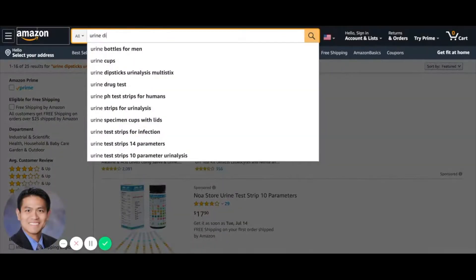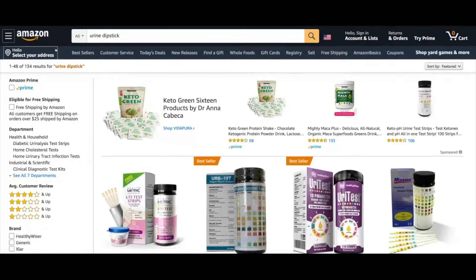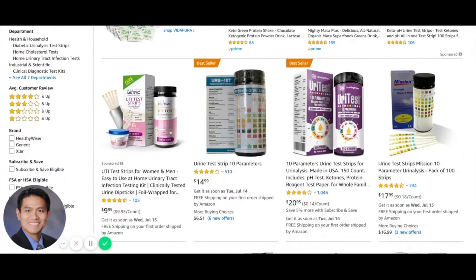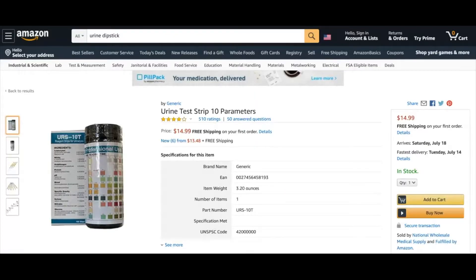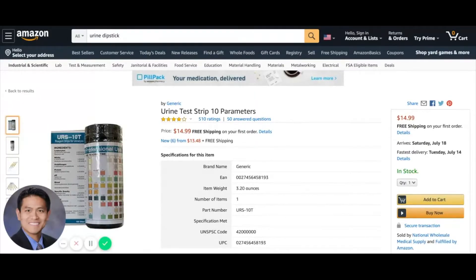You can buy these urine dipsticks off Amazon — you don't need a prescription or anything. Usually the ones that I use in my clinic are a 10 parameter test strip. I put a link down in the comment section below for the specific type that I would probably recommend getting. I'm going to show you how to use the dipstick and also how to interpret it to see if you might have a urinary tract infection.